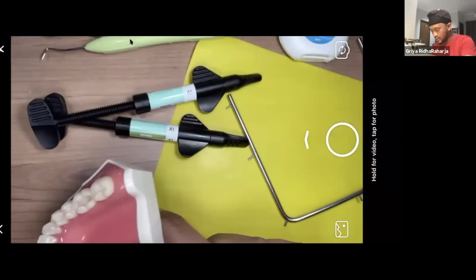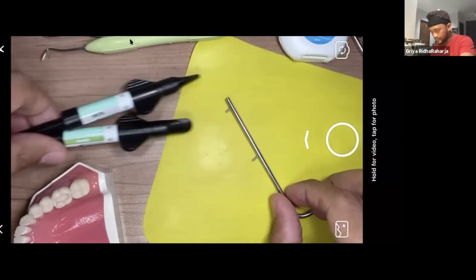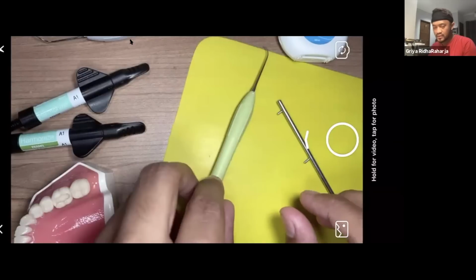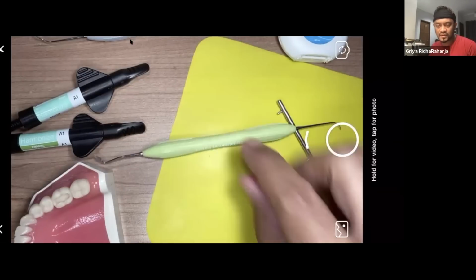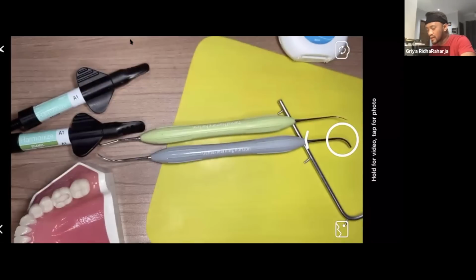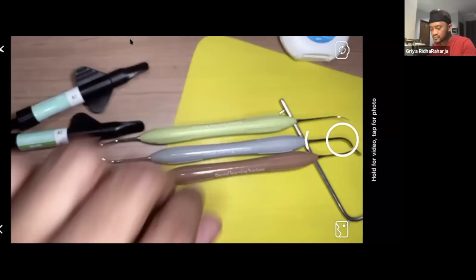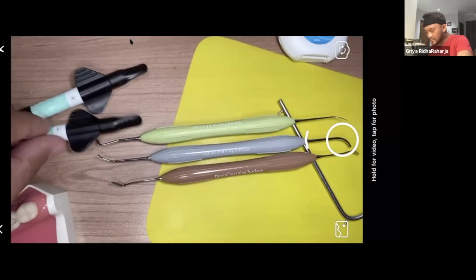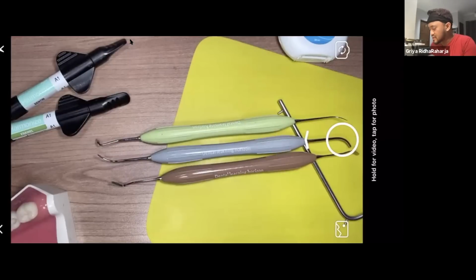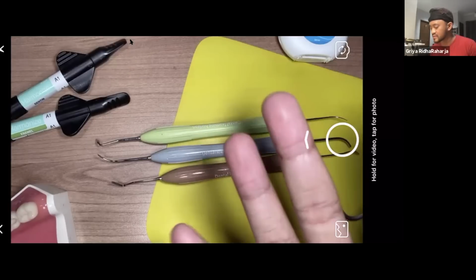So how about my instrument? This is my instrument. This is not the LM Arte. This is like a copycat of the LM Arte. This is the cheap one because I love cheap. It's maybe around $100 for 5 items, 5 years.